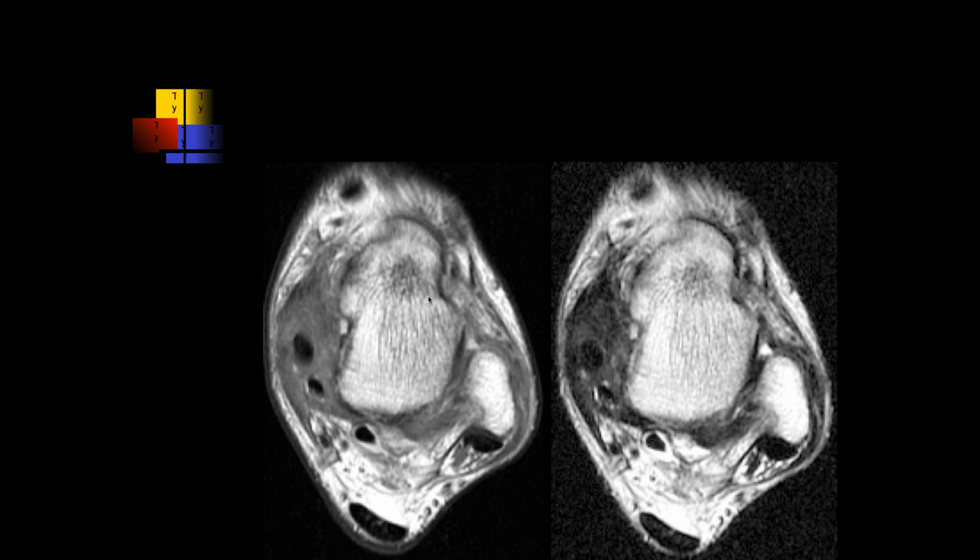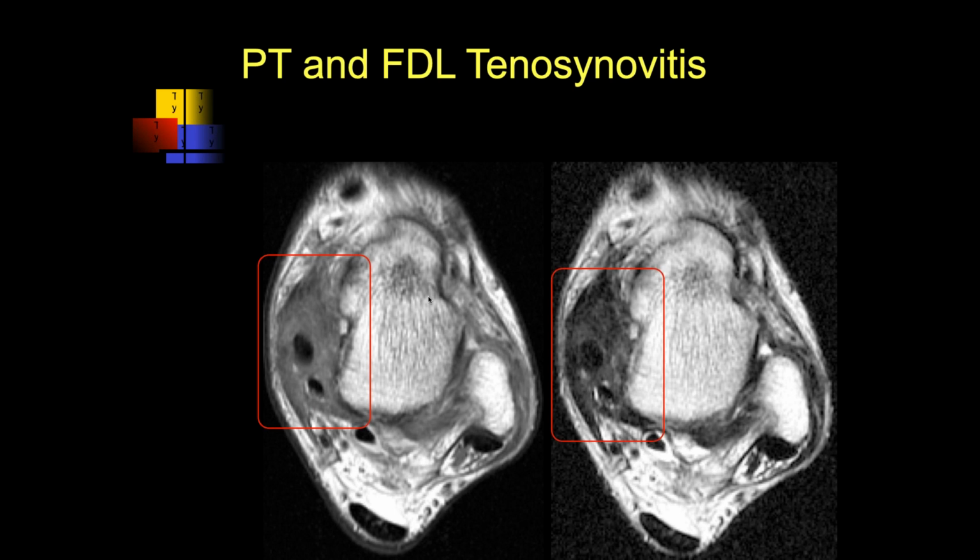All right, so here there is diffuse thickening surrounding that posterior tibialis tendon. It looks like scar tissue. I don't see a lot of fluid, so this is probably chronic, at least moderate to severe tearing and tenosynovitis. Yeah, so this is more chronic tenosynovitis, probably from chronic inflammatory change to the synovium around the PTT and the flexor digitorum. And over a long period of time, you lose the acute inflammatory appearance and it becomes more fibrous as fibrosis replaces the acute inflammatory disease.